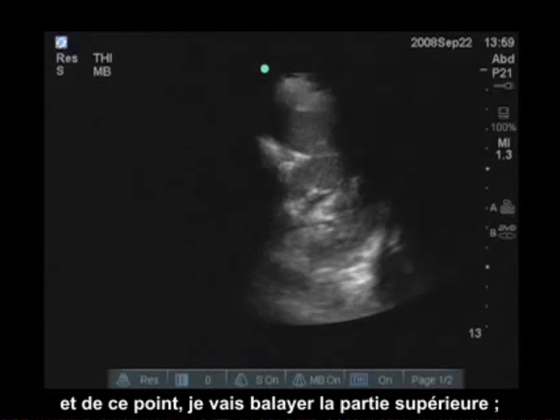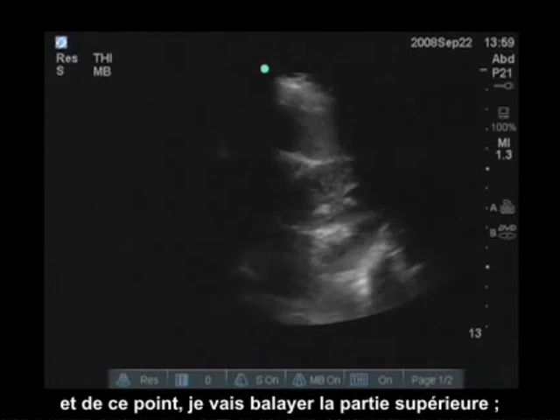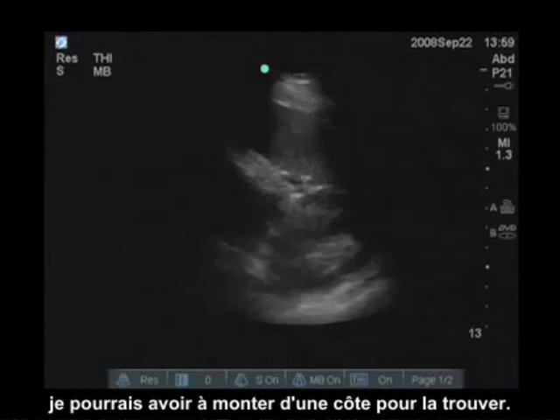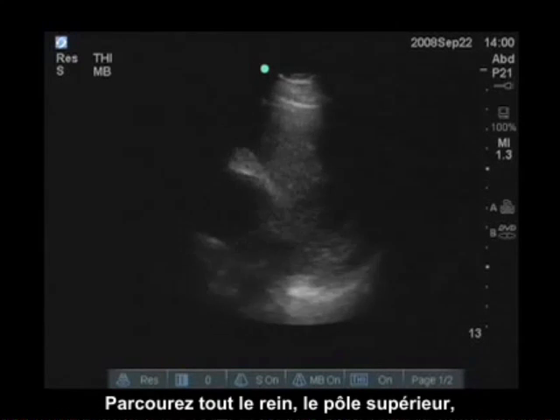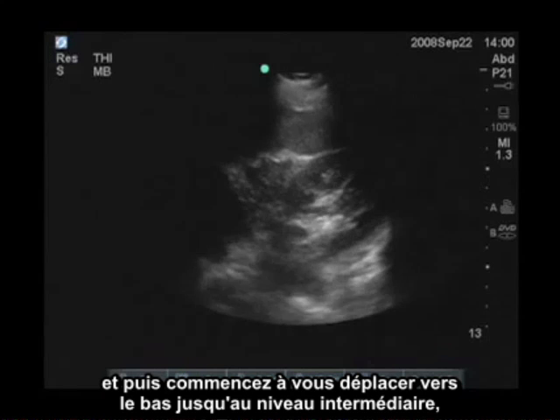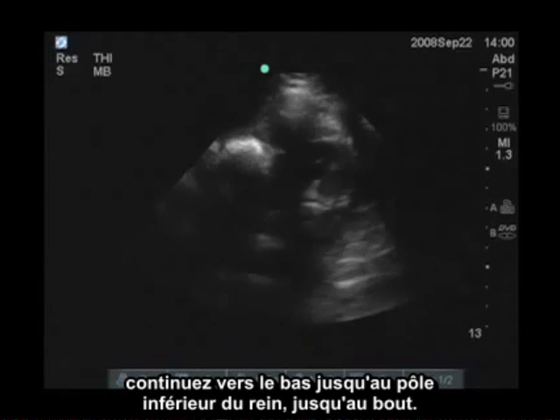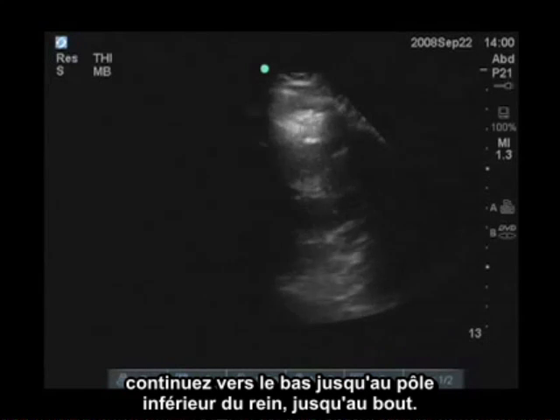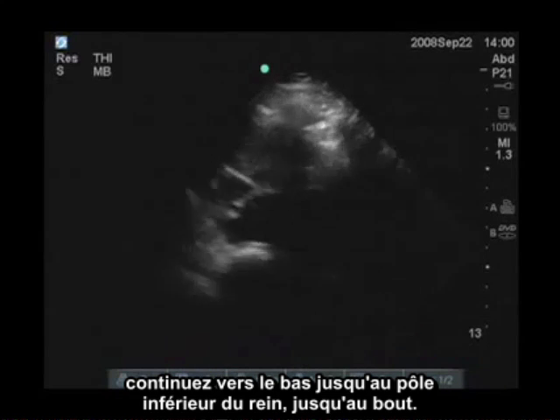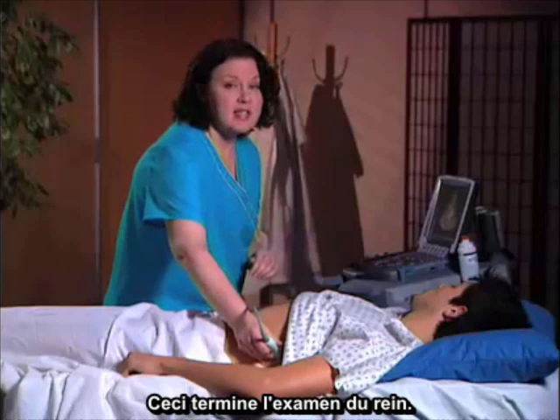From here, this is my midpoint, I'm going to sweep superior. I might have to go up a rib space to find it. Go all the way through the kidney, the superior pole, and then start to move inferiorly to mid-level, continue on down, inferior again, to the lower pole of the kidney, and all the way out. So that completes the kidney evaluation.